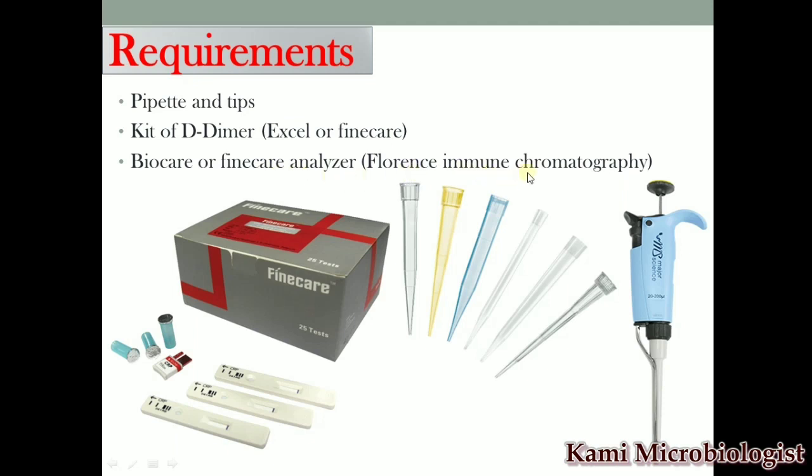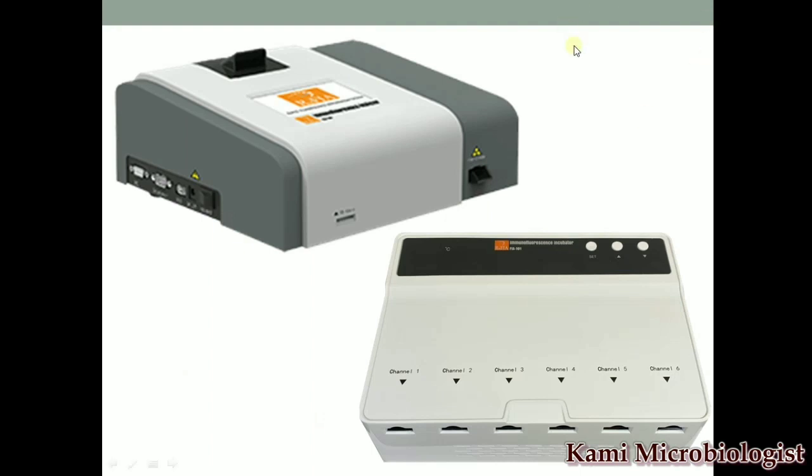We call it fluorescence immunochromatography. This is actually a machine on which we mostly run this test. Let me show the machine. So this is the machine, the immunofluorescence machine. This is the analyzer. Now this analyzer mostly comes with this incubator, in which we insert our strip.